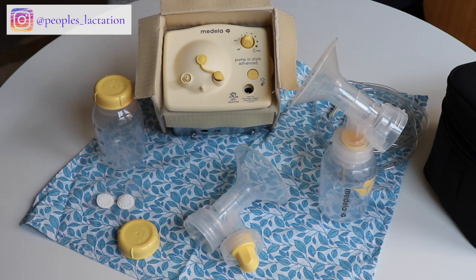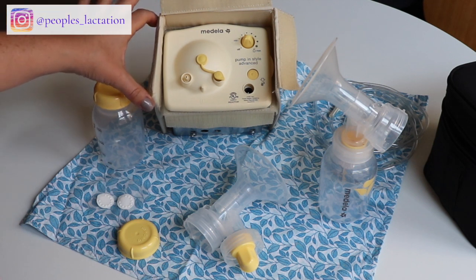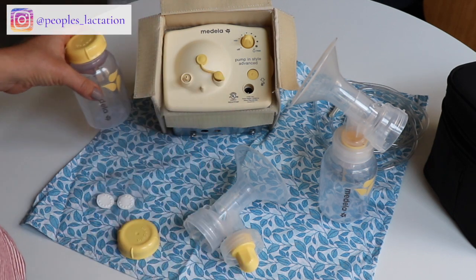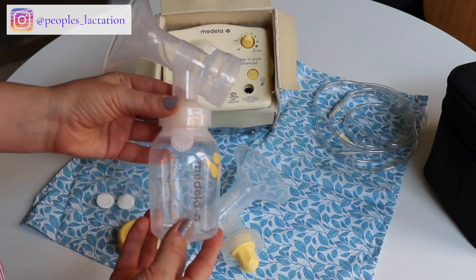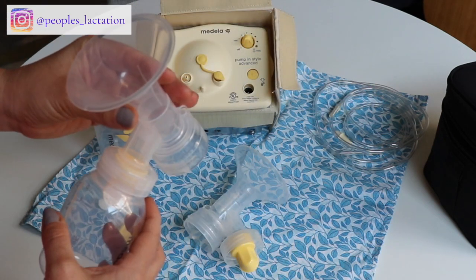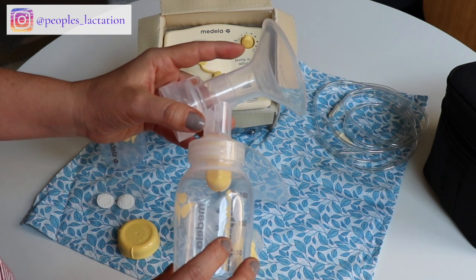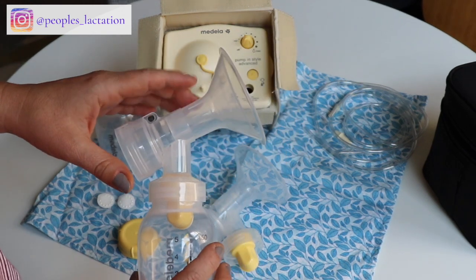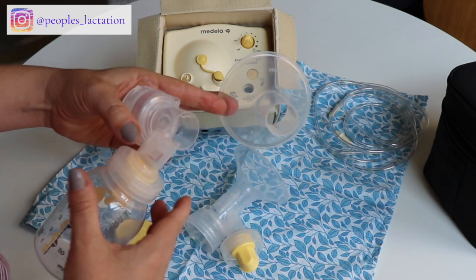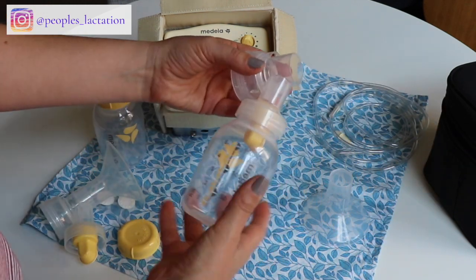This pump has dual-phase suction, so you have the letdown phase and the expression phase, which we're going to talk about how to change between. You're going to see that you get two bottles, and when you set it up for pumping it's going to look like this. The Medela kit tends to come with a 24-millimeter flange and a 27-millimeter flange; if you get one it's probably going to come with the standard 24. You can order larger flange sizes as needed.